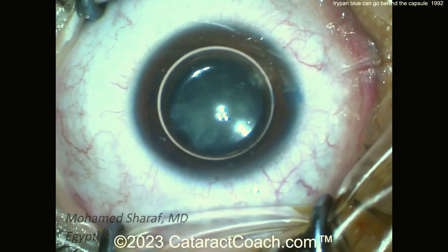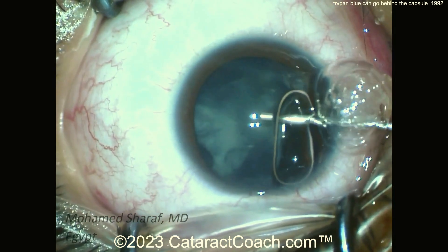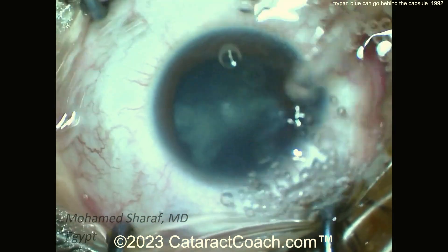But yet in this case, it went behind the lens into the vitreous cavity. And you'll notice, as we do the case here, there's going to be no red reflex.